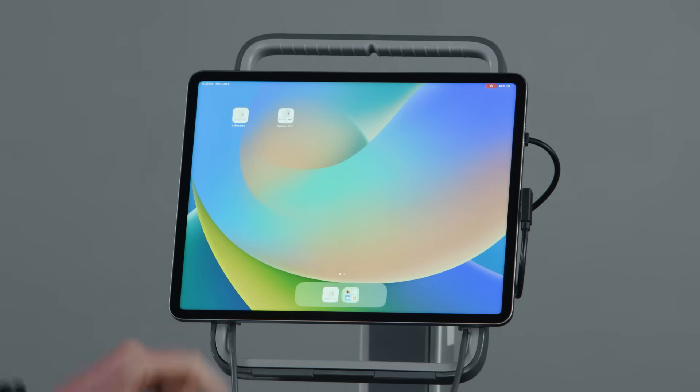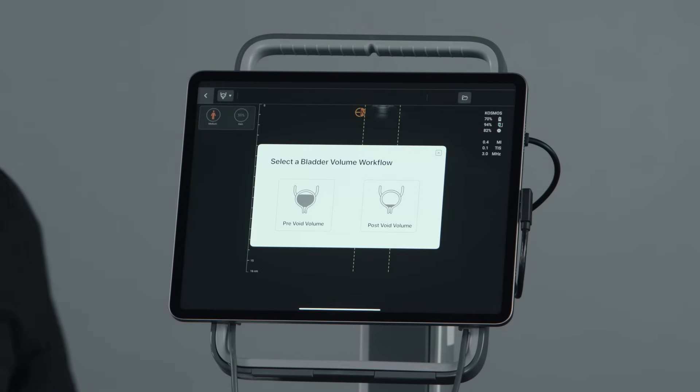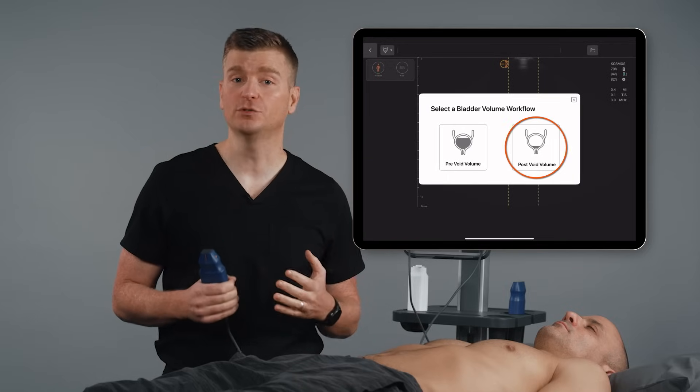Let's complete a quick walkthrough using Cosmos Bladder. First, I'm going to select the Cosmos app. Next, select the Bladder preset to start your scan. Next, select either pre-void volume or post-void volume.